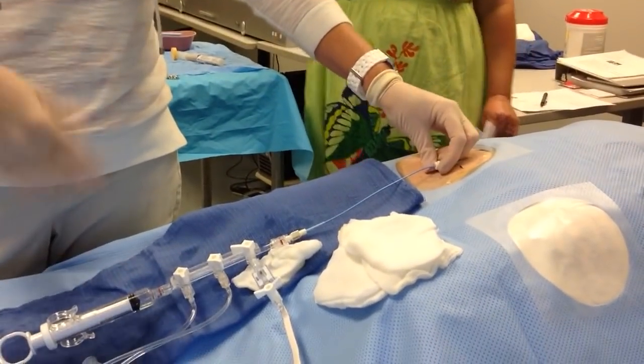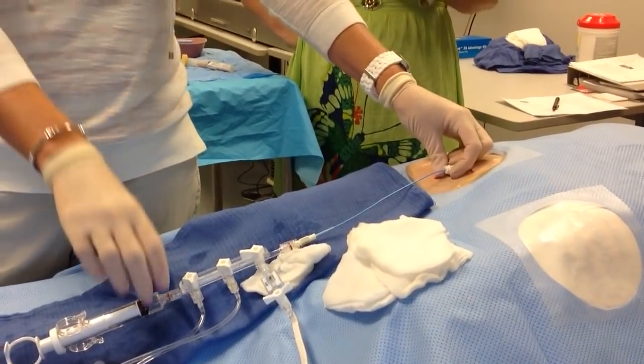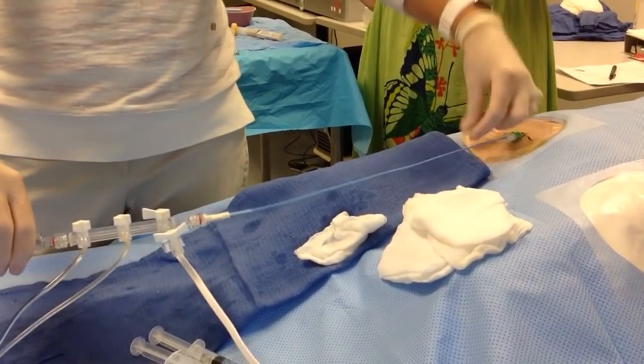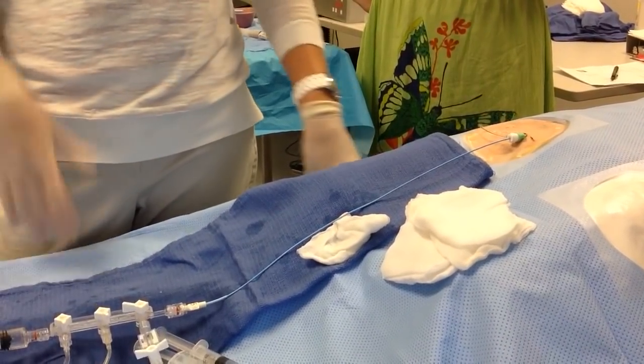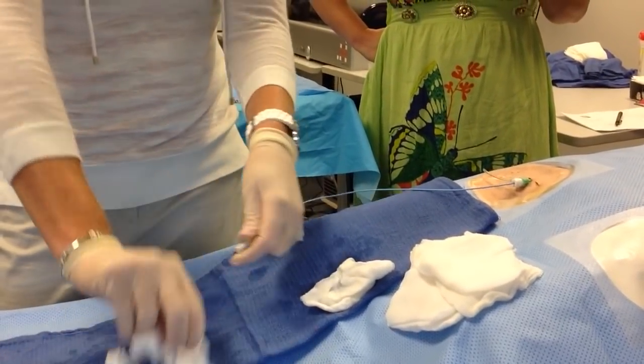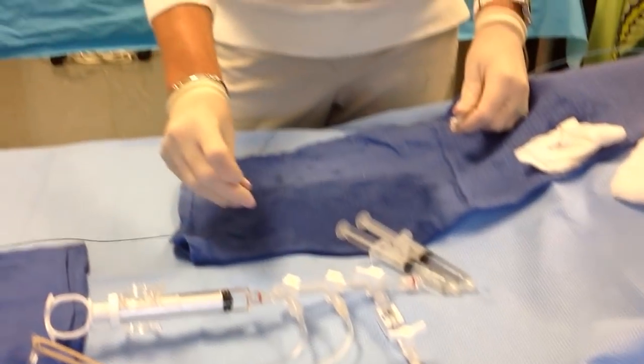A lot of times they let you do this. You just watch it on the monitor. And you just pull back real slow. And you're watching it go from LV to AO. And you just lay it down. And then they'll say finished recording. When they're finished recording, you disconnect. And we always take the pigtail out with the wire.